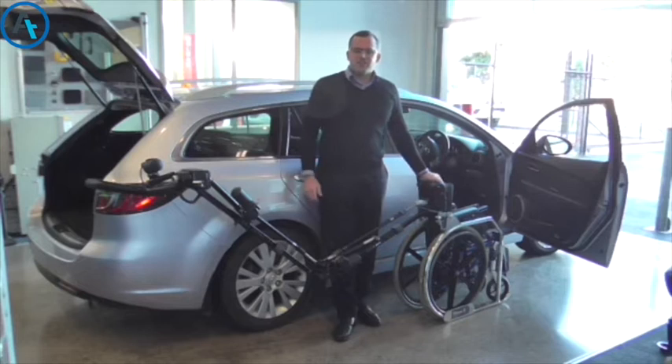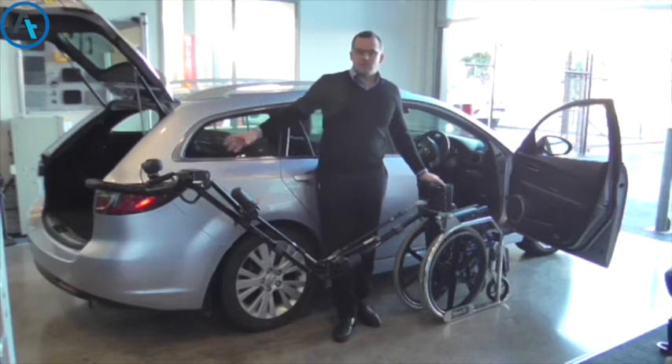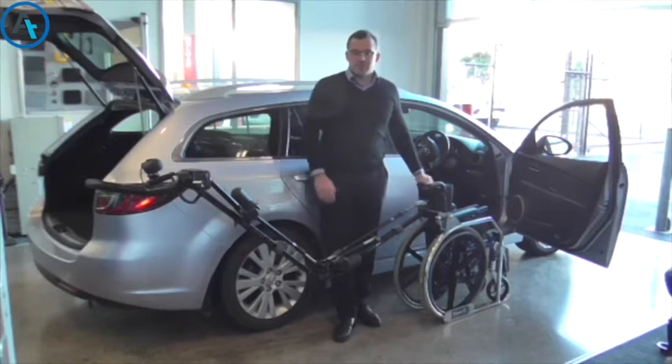Good morning, I'm Daniel from Autotransform and today's video is on a new product we have — a robotic wheelchair arm. This is to get the wheelchair in and out of your vehicle and up to the driver's door.